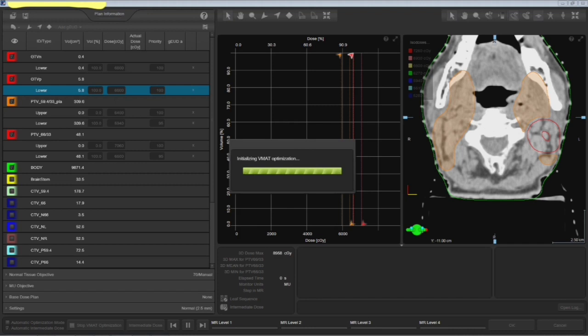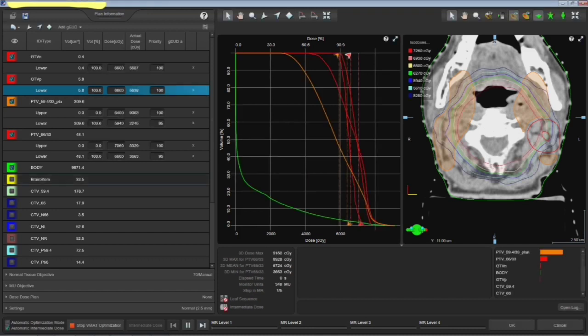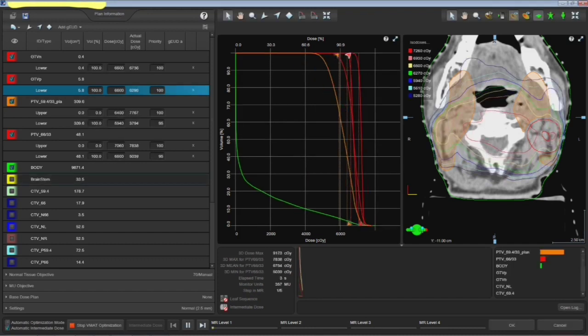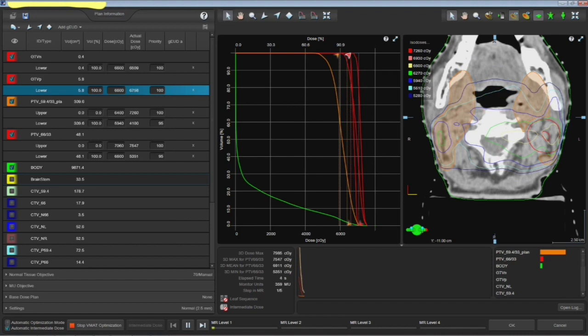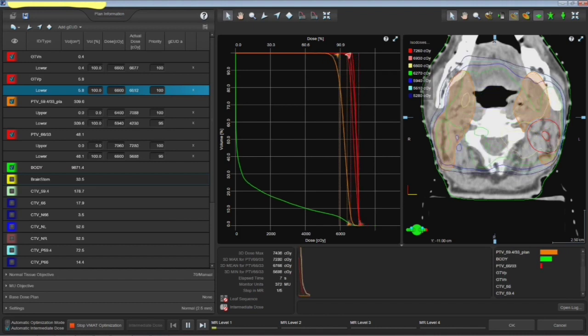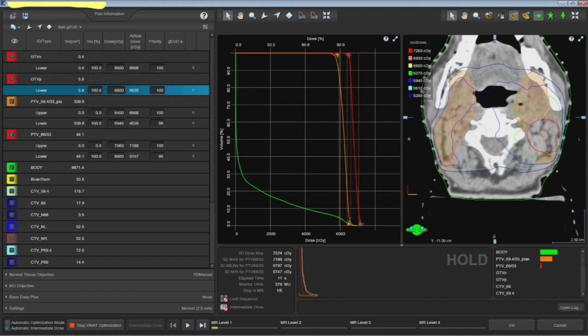To give a GTV also in constraint because when it is a target masking, the PTV, the optimization algorithm is going to have lots of points on the surface of the PTV but not the GTV. So one should definitely give a GTV if there is a GTV or if there is a GTV primary. The constraint should be given to it as well. That is because the target masking system in PO does not look into the PTV, it just looks into the surface of the PTV.